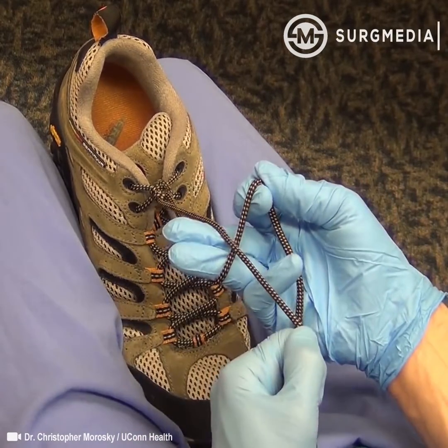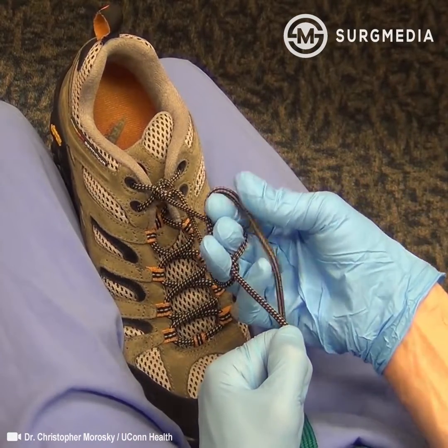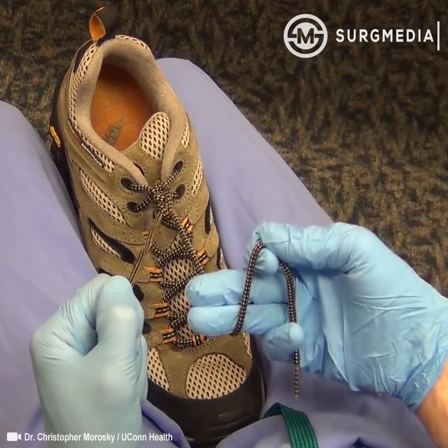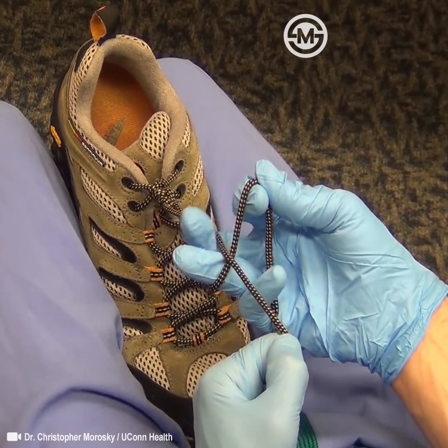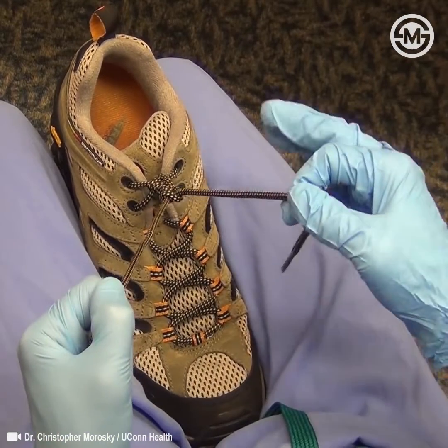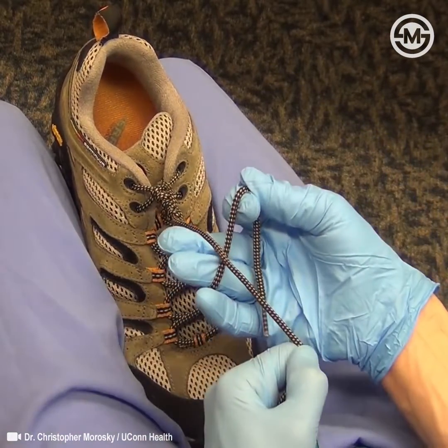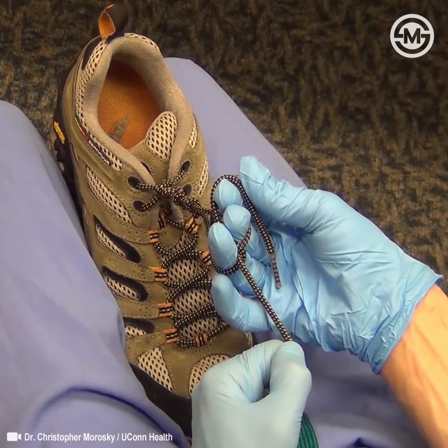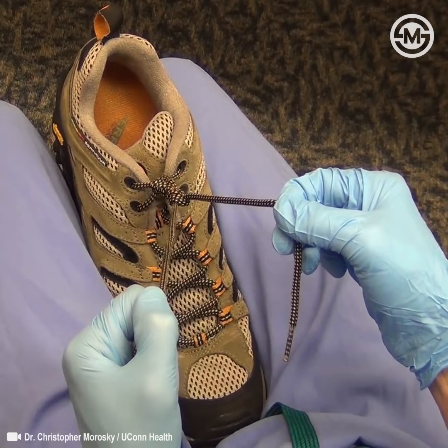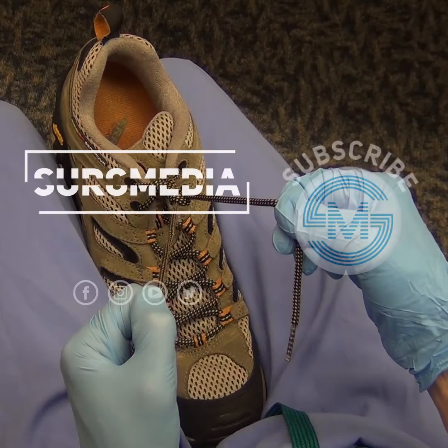Practice the sequence: karate chop, suture circle, grab that tail, flick it through. And one more time — karate chop, suture circle, grab the tail, flick it through. You're halfway there. That's the karate chop.